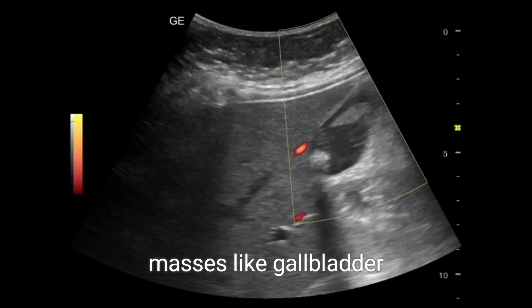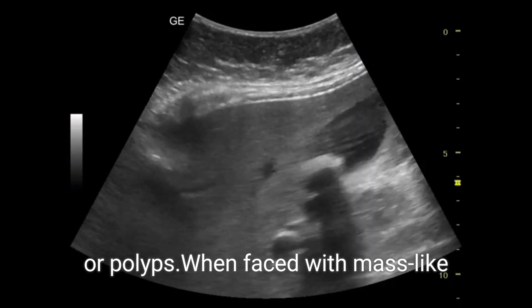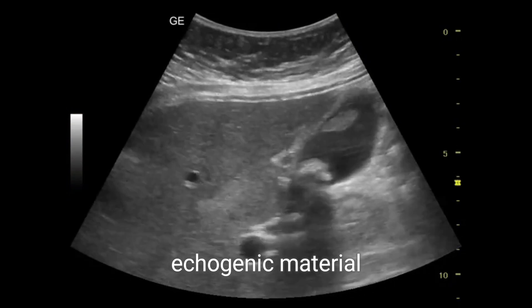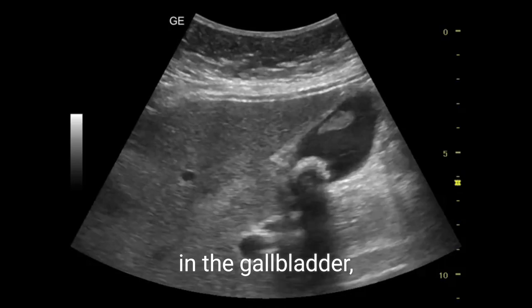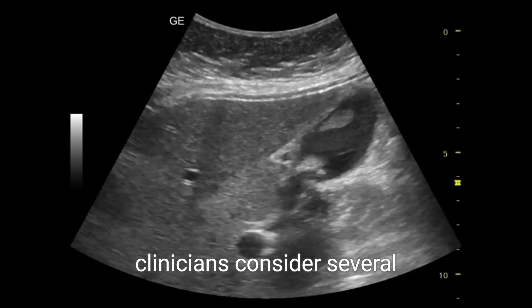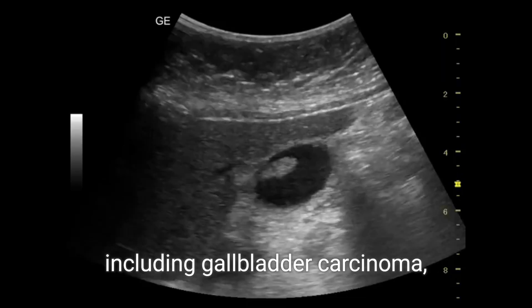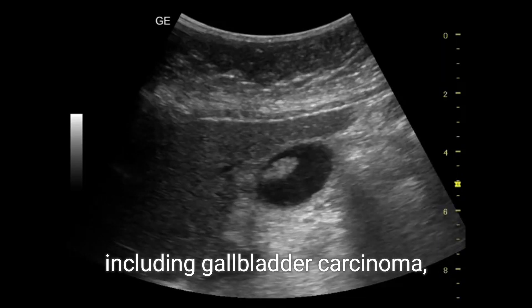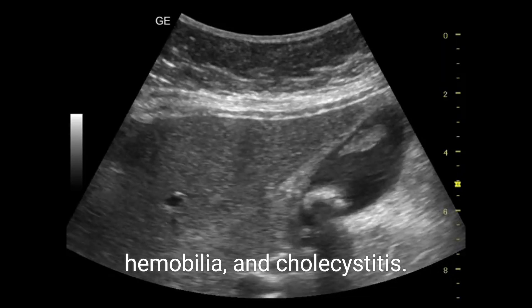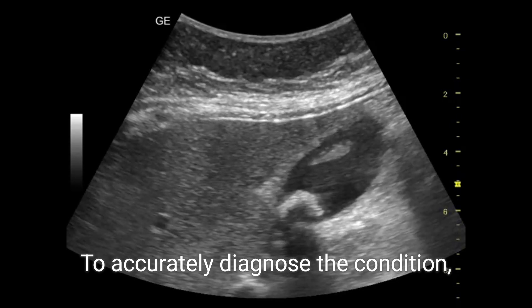Color Doppler distinguishes sludge from vascularized masses like gallbladder carcinoma or polyps. When faced with mass-like echogenic material in the gallbladder, clinicians consider several differential diagnoses, including gallbladder carcinoma, polypoid lesions, hemobilia, and cholecystitis.